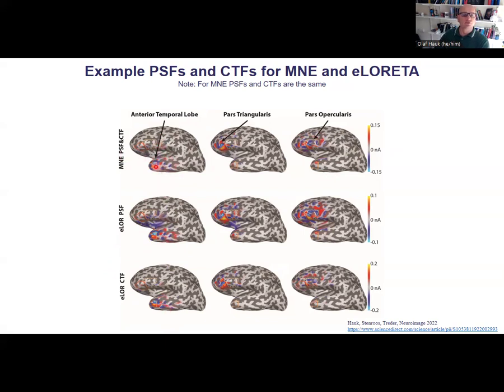And in this case, if we look at MNE, well, generally speaking, we can say whatever happens in anterior temporal lobe stays in anterior temporal lobe. In the point spread interpretation, if there is a source in anterior temporal lobe, the activity is more or less confined to the region of interest that we outlined here. However, there is some leakage to outside this region as well, but at least it's close by. I don't see very much here in the inferior frontal lobe.